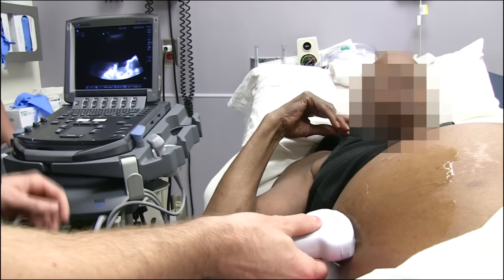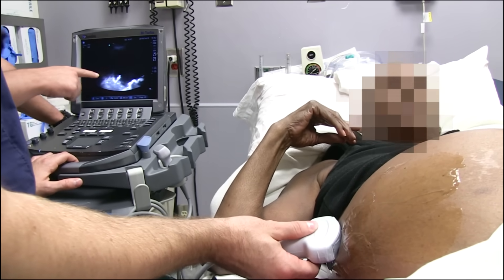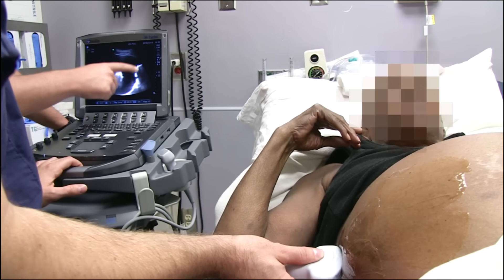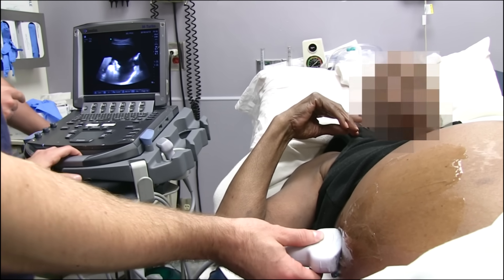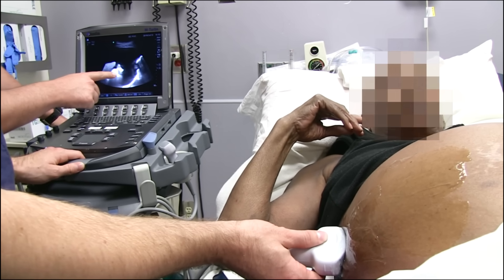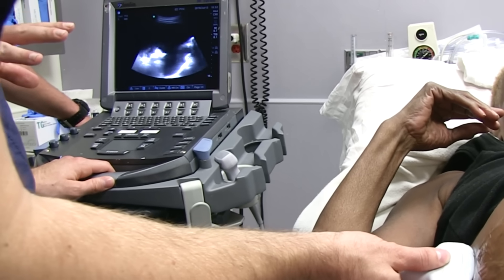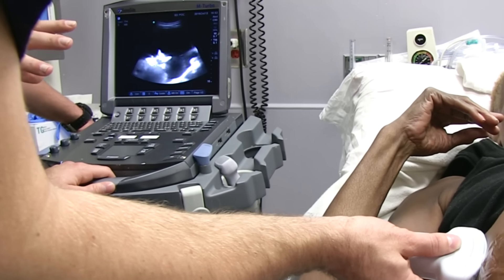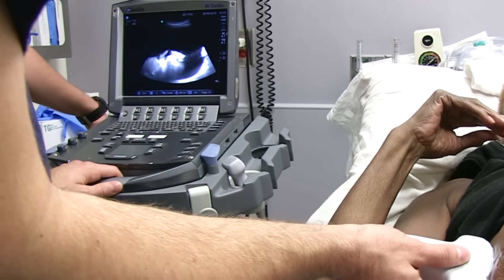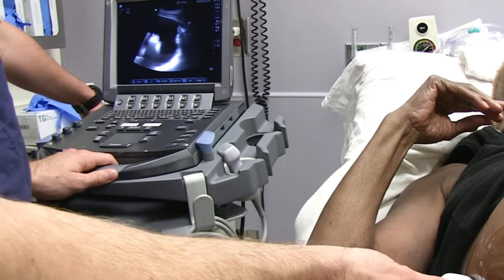Come up north towards the head. Great — so we see the posterior here, here's the liver, and all this black — in ultrasound terminology, anechoic fluid — is the ascites that we're looking to drain. We can see bowel with omentum kind of waving in the ascites. We're window shopping, trying to find the best place to go.